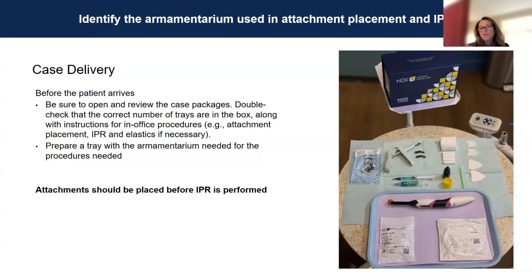So for teeth that are not crowned, you would want to use 30 to 50%. I think 50% is a little bit high. Most of your etching gels or liquid, I like to stay around 35% phosphoric acid. And on my tray, I would have more of my micro brushes in case there gets some saliva contamination.